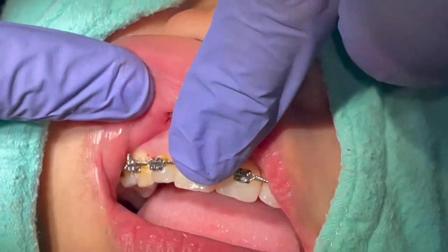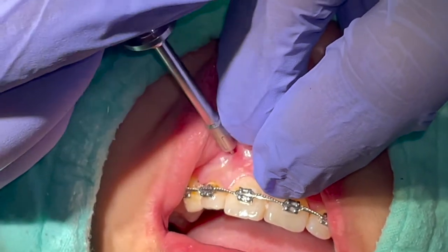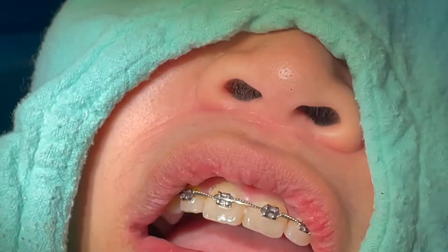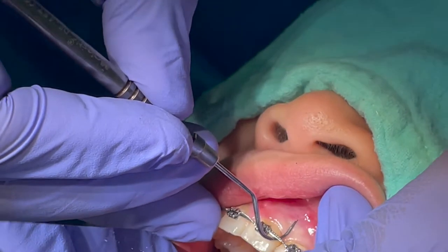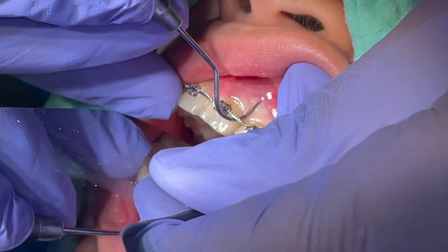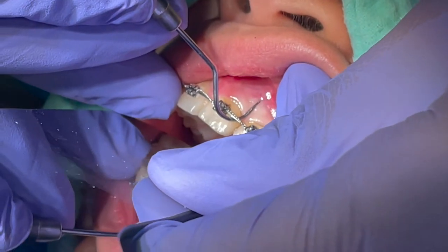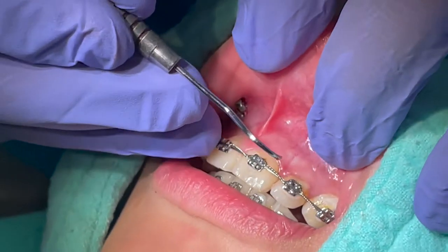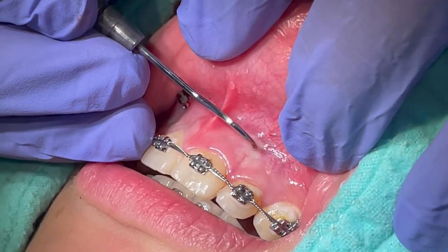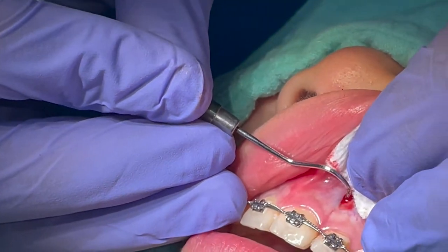Orthodontic treatment is a lot better today because of TADs. After a very minimal application of anesthesia, I determined the insertion site by making a vertical indentation on the gingiva using an explorer. This indentation is based on the imagined position of the roots of the incisors, by looking at it from the incisor using an intraoral mirror. I then punch a hole to mark my insertion site. At this point, the screw is ready to go in.